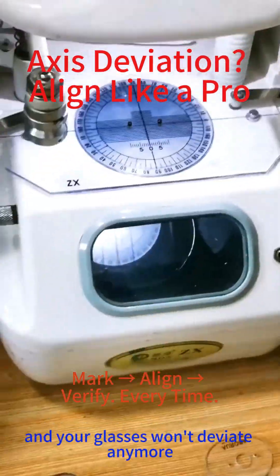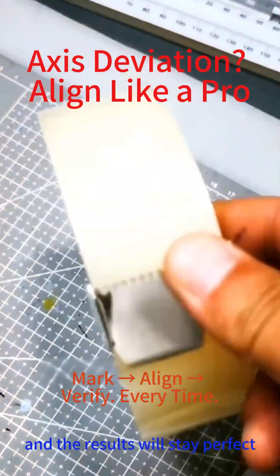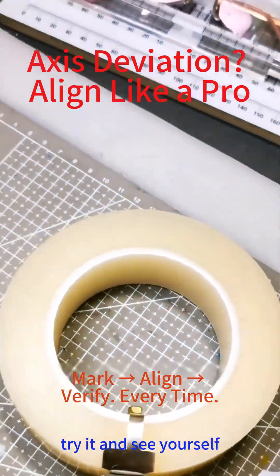And your glasses won't deviate anymore. Use quality anti-slip pads and the results will stay perfect. Try it and see for yourself.